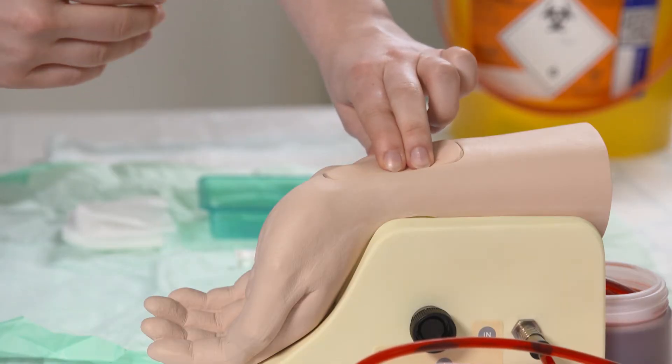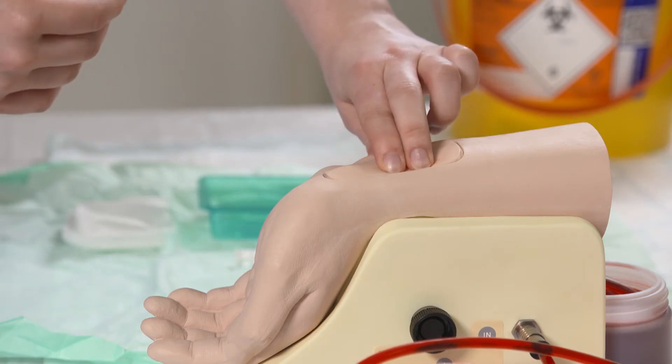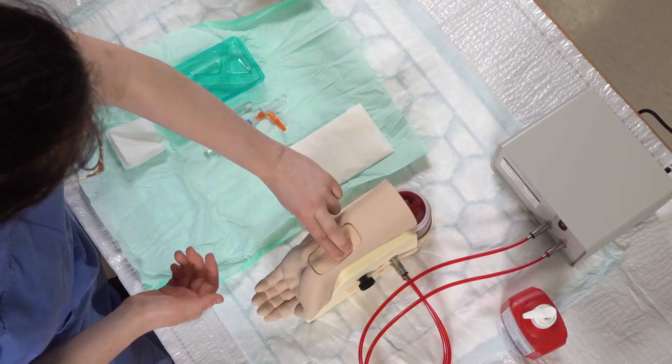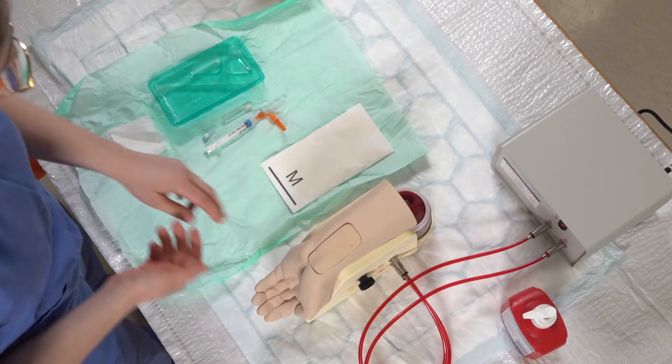Usually I would palpate both arms and also do an Allen's test to ensure good circulation. I'm happy with the pulse that I've got here, so I'll move on to my equipment.